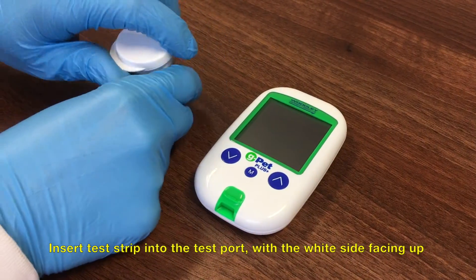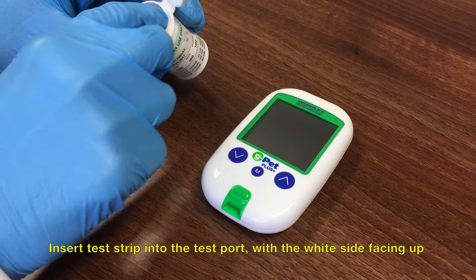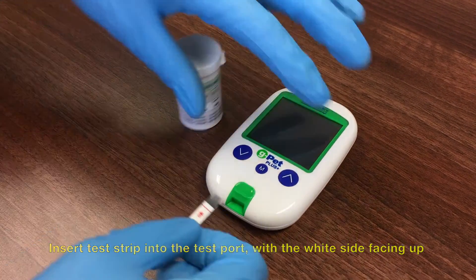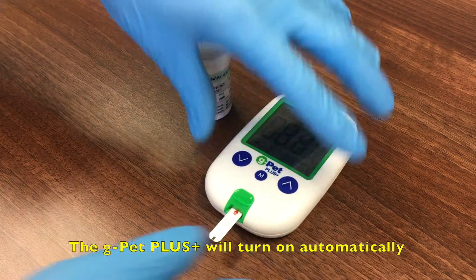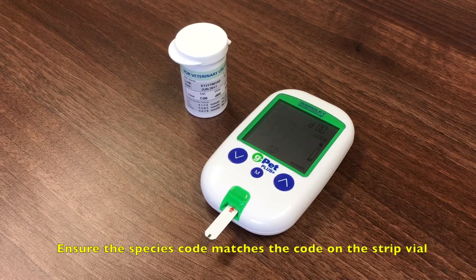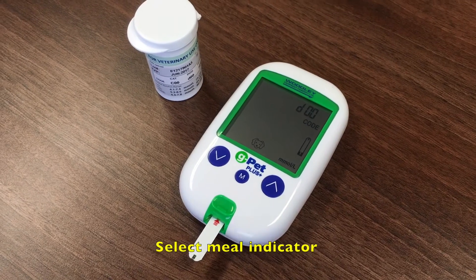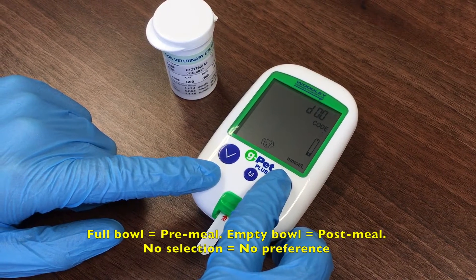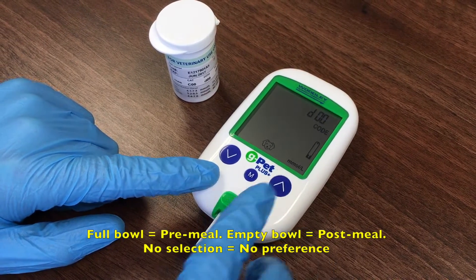Remove a test strip from the vial and recap. Insert the test strip into the test port with the white side facing up — the GPET Plus will turn on automatically. Ensure the species code matches the test strip vial and select the relevant meal indicator: a full bowl symbol for pre-meal and an empty bowl for post-meal. Alternatively, leave the selection blank.